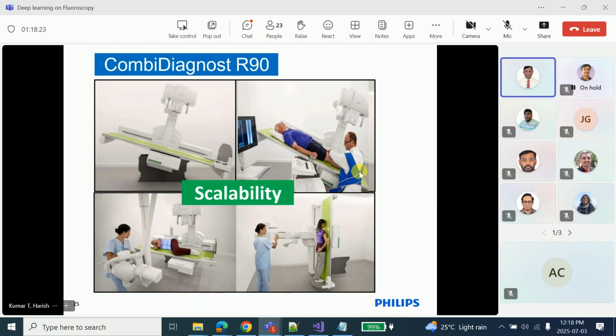The patient can be on the table, tilt the table, position your fluoroscopic tube, which is the first tube, and do your chest X-ray. You can also do cross-table X-rays, where the patient can be on the table, bring the CSM over the table and perform. So these are the different ways that you can use this system in combination to perform almost all types of X-rays.